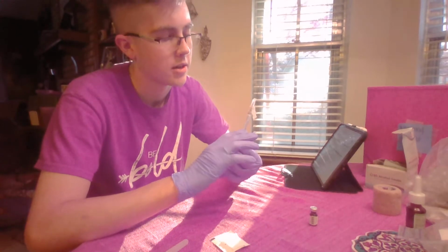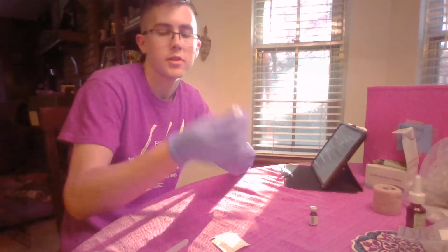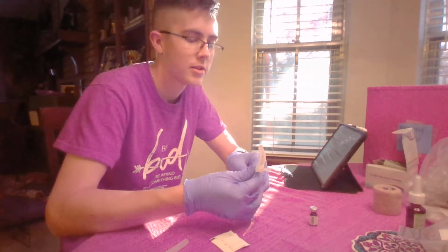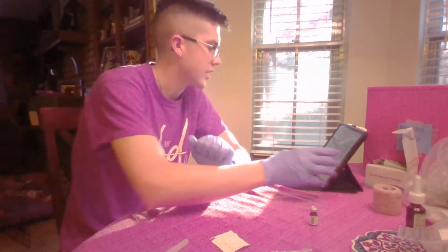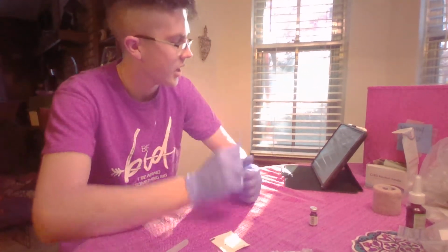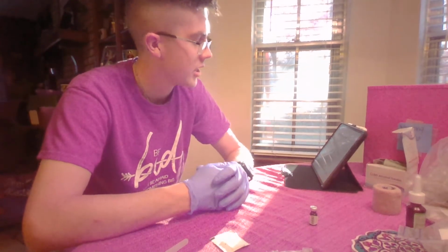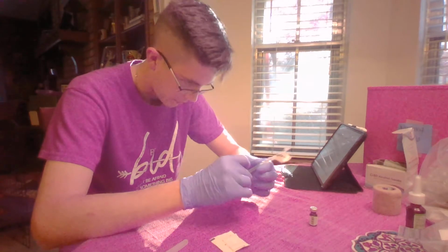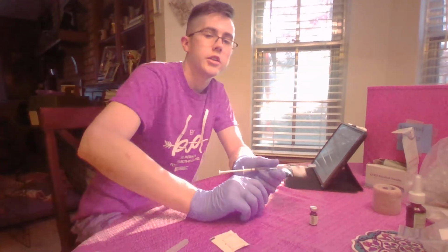Move all the air bubbles out. Okay, place this in the sharps container, grab my atomizer, put that on, set that aside. After I've done that, that's whenever I place PPE on, and then this is whenever I would stop my ventilations, go over and check with my patient.